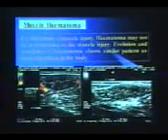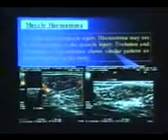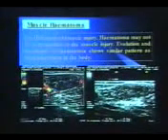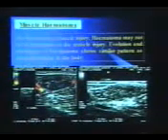What we get everywhere in the body, and it is where we can see. The point is this: why ultrasound is so helpful. Clinically, it is not possible to know how big the hematoma is. Clinically, you cannot see. Apparently, by naked eye or palpation, it may look like a small hematoma, but ultrasound helps.